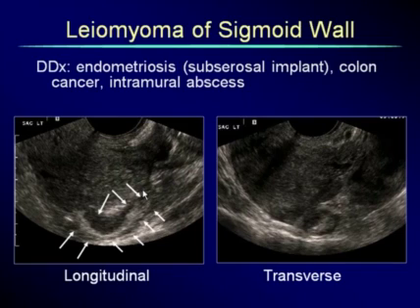Sometimes ultrasound triumphs in making a really good call. This patient had pelvic pain. It was chronic. She had multiple different studies and came one day for this ultrasound. Her pelvic organs were completely fine, but we noticed this unusual kind of hypoechoic structure. As we looked, we evaluated, we saw that there was peristalsis going through here.